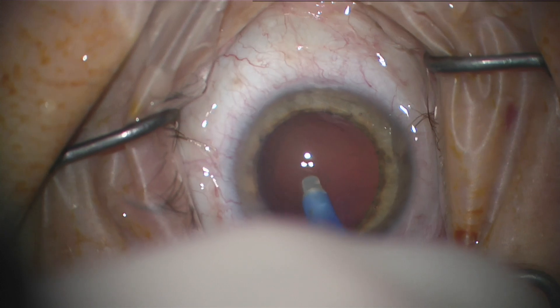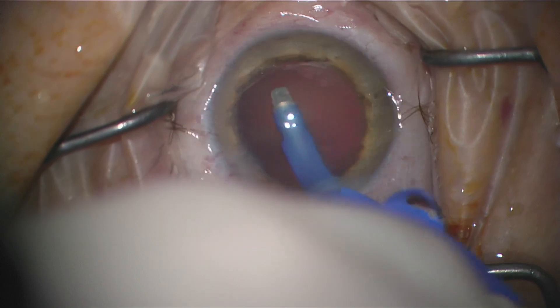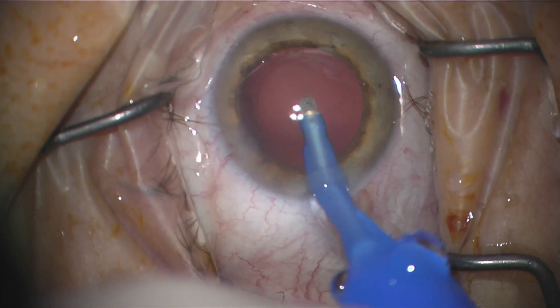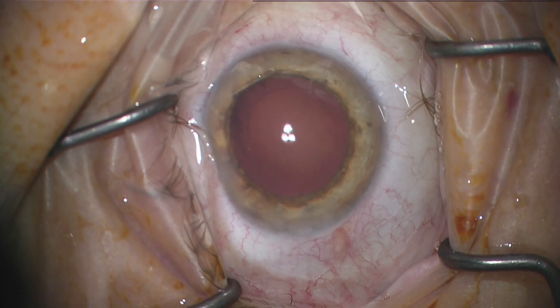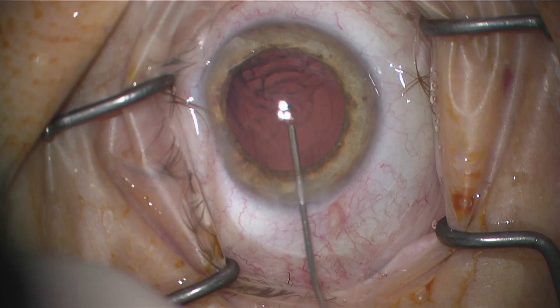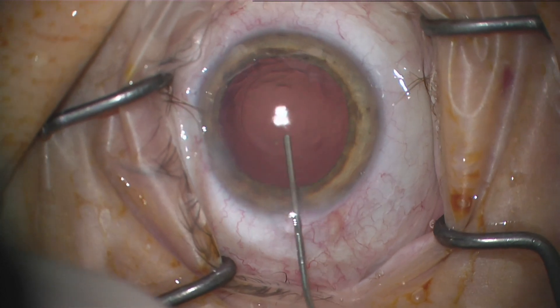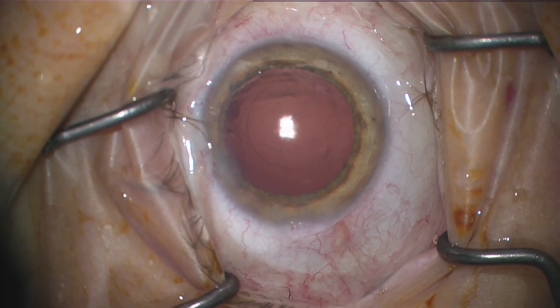What I'm showing you is the process of using something new in the eye. From what you can see on screen it looks similar to a regular phaco and IA unit, but it feels very different in your hand — it's a pretty large handpiece, so it feels bulkier. But again it's only in your hand; you don't have this huge machine to deal with, so that's kind of nice.